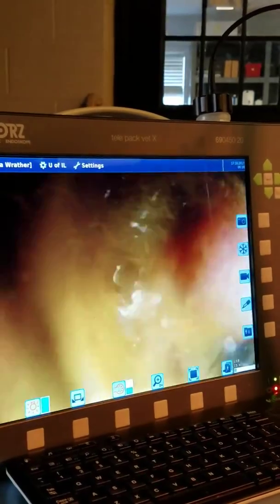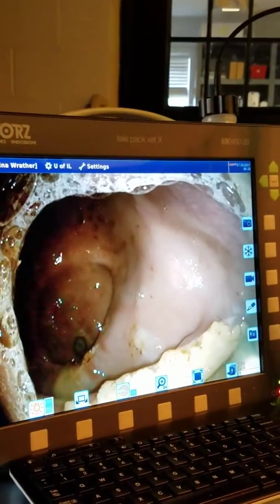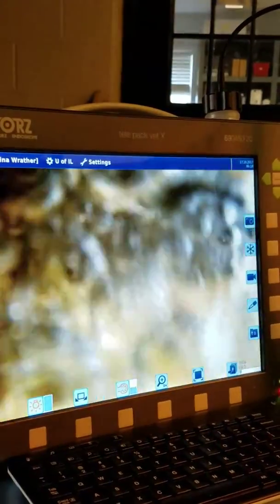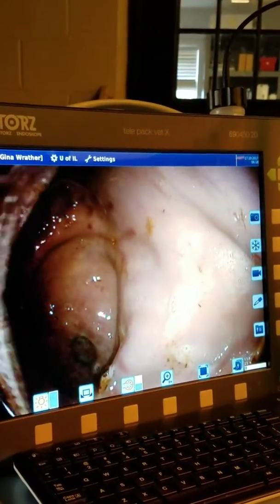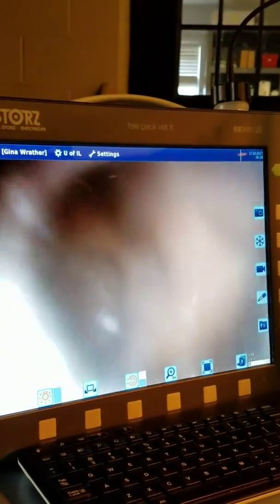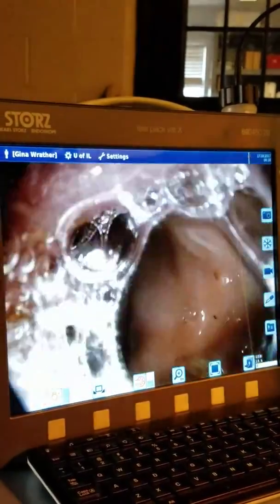My stomach is constantly moving while we're doing this — a little bit of a struggle sometimes. I just want to go in a little bit more. I think there's a little cluster of them over there. I'm trying to get past these bubbles in my way.